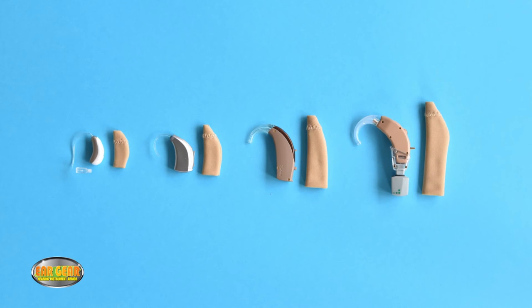Eargear is available in four sizes to fit hearing aids: Micro, Mini, Original and FM.